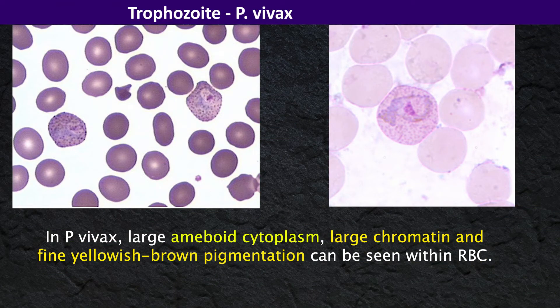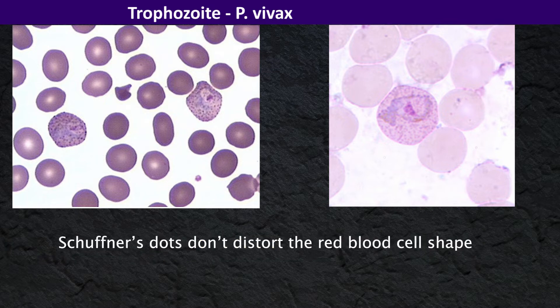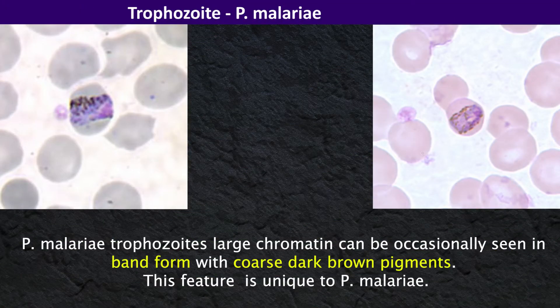In Plasmodium vivax, large amoeboid cytoplasm, large chromatin, and fine yellow-brown pigmentation can be seen within red blood cells. But unlike Plasmodium ovale infections, the Schüffner's dots seen in Plasmodium vivax don't distort the red blood cell shape — it actually stays more rounded without a feathered edge. In Plasmodium malariae trophozoites, large chromatin can occasionally be seen in band form with coarse dark brown pigments; this feature is unique to Plasmodium malariae.